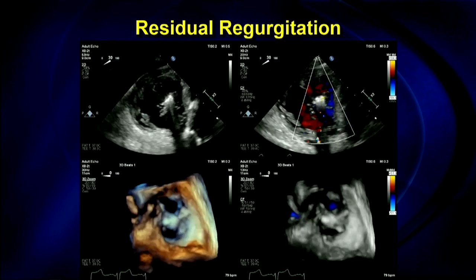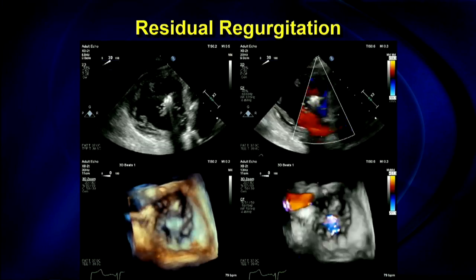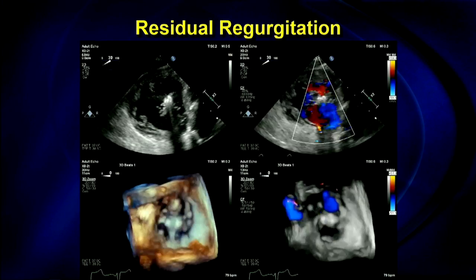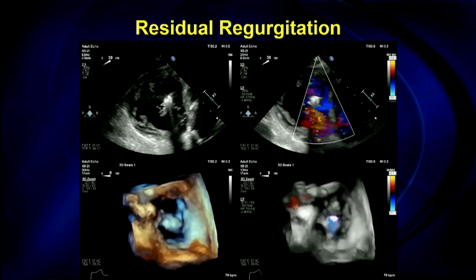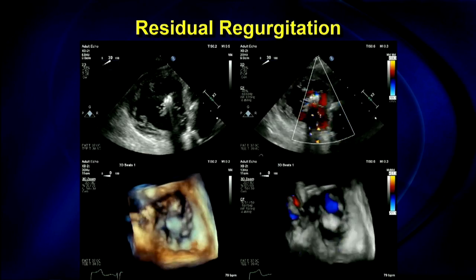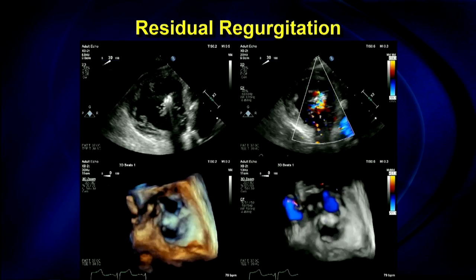After the clip is closed, in the same view, you can really see leaflet insertion well, a nice tissue bridge. You can see if there's residual tricuspid regurgitation; here, there's some anterior to the clip. And you can see that on 3D as well, but just not with as much spatial resolution.